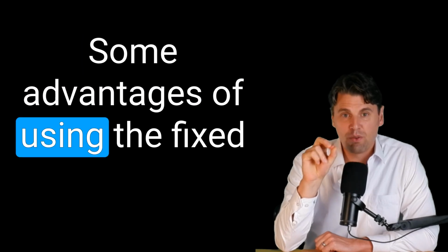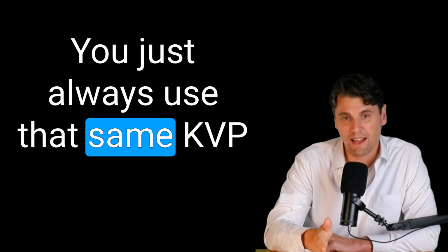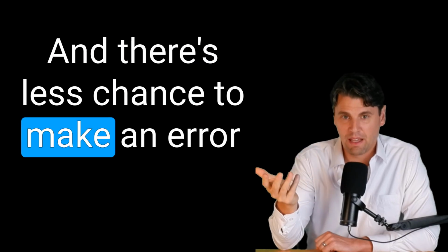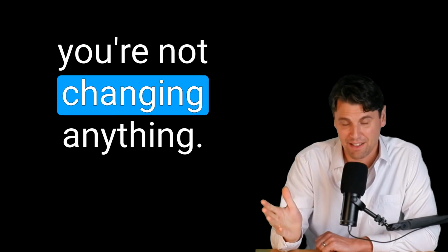Some advantages of using the fixed KVP is that it's simple, right? It's dead simple. You just always use that same KVP for that same type of exam. And there's less chance to make an error in that case by changing things because you're not changing anything.